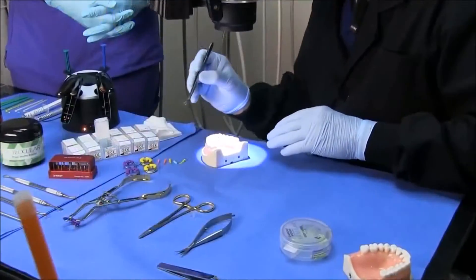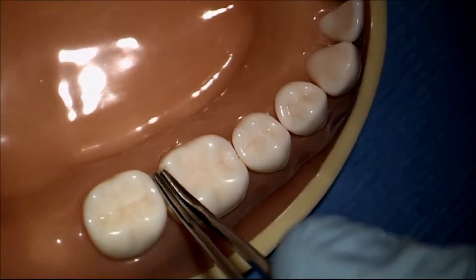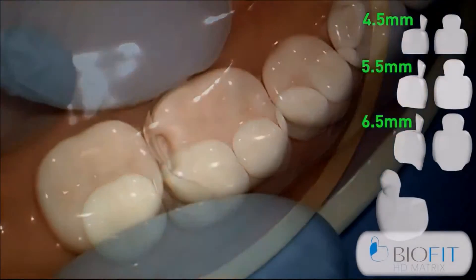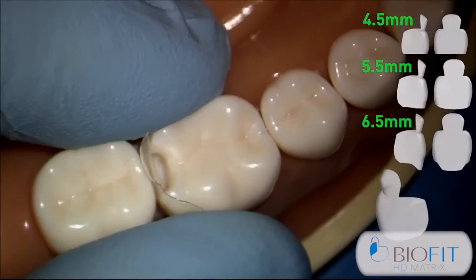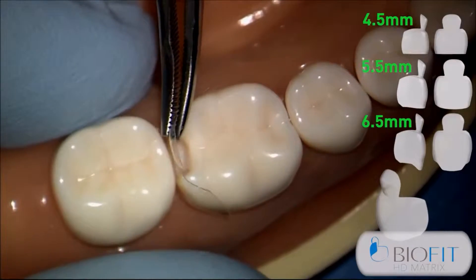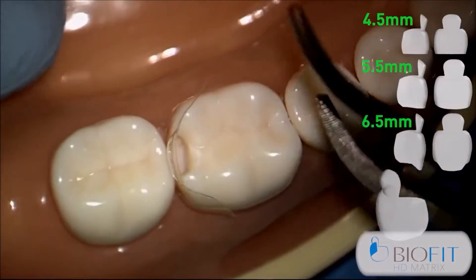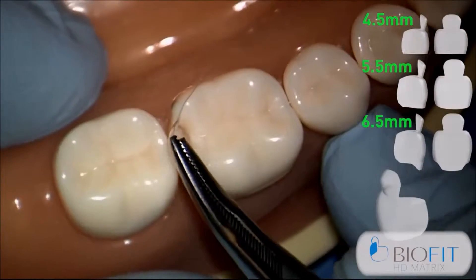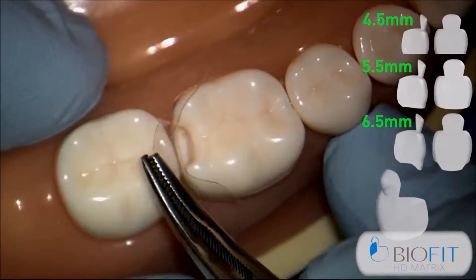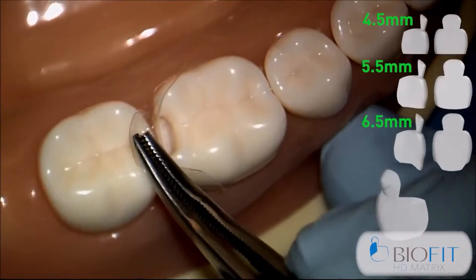The new Bioclear posterior matrix has a tremendous anatomical shape with some new features. We need to make sure that the tab is centered over where the restoration is going to be placed. This is a great advantage because we're going to fold this tab down, which will prevent any composite from going on the wrong side of the matrix.